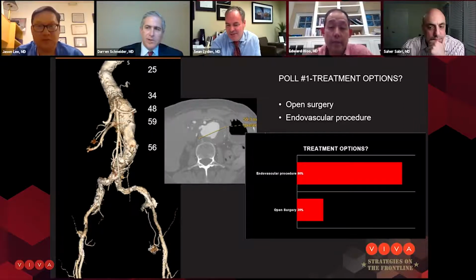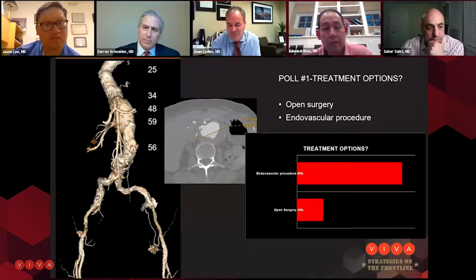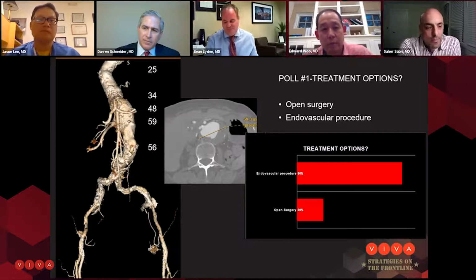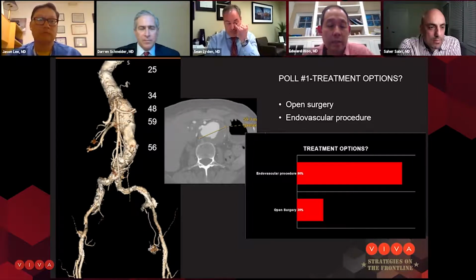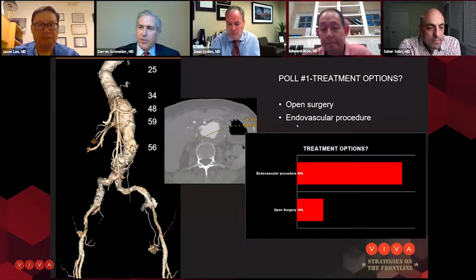So, I think we've got a bunch of comorbidities, and an endovascular option is really nice. We've had a lot of success, and Jason, obviously, you pioneered a lot of the literature with the parallel grafting. Darren's great. Darren's on the panel, and he's obviously got a wealth of experience with his IDE and treating it with that technique. And I think either approach probably would be reasonable with this patient. Yeah, I would agree.